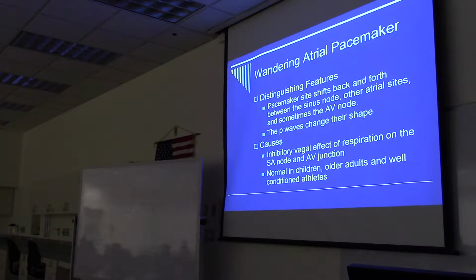This can be caused by an inhibitory vagal effect of respiration on the SA node and AV junction. It could be normal in children and older adults, as well as conditioned athletes.